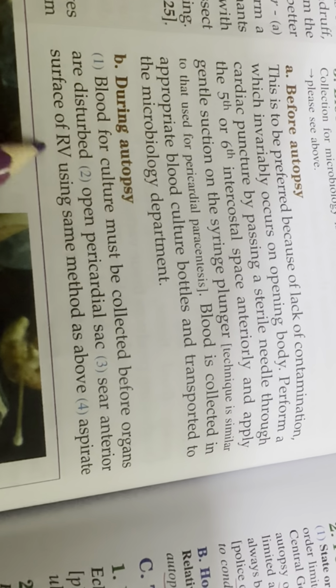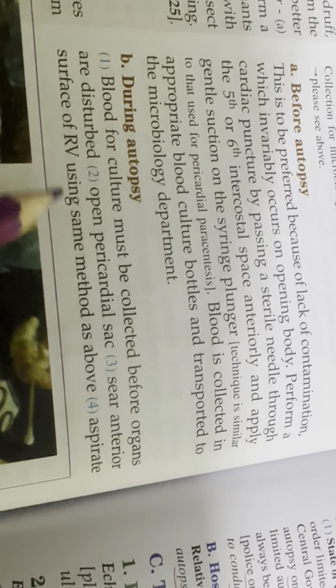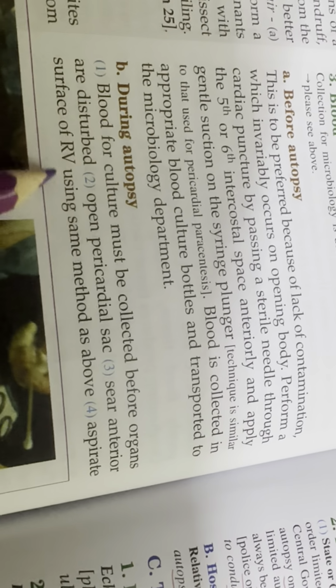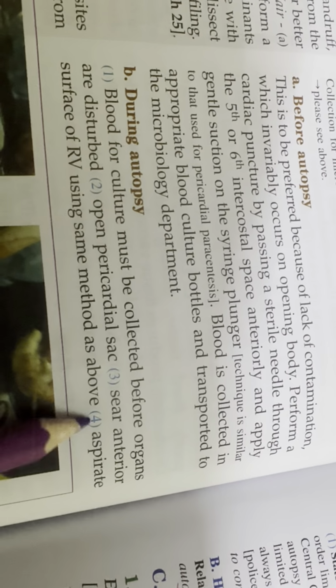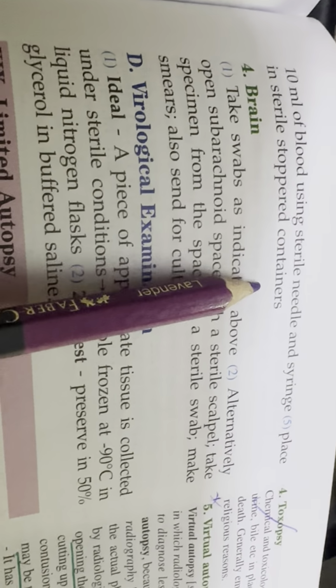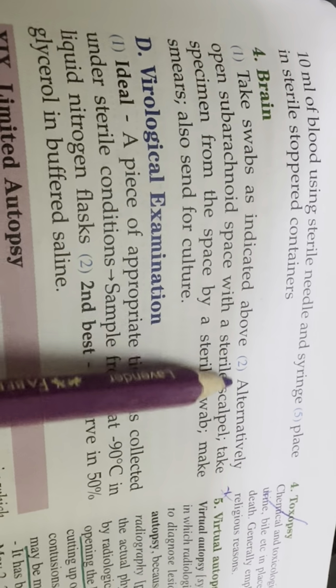During autopsy, blood for culture must be collected before organs are disturbed. Open the pericardial sac, sear the anterior surface of the right ventricle using the same method, and aspirate 10 ml of blood using a sterile needle and syringe. Place it in sterile stoppered containers. Brain: take a swab as indicated above.